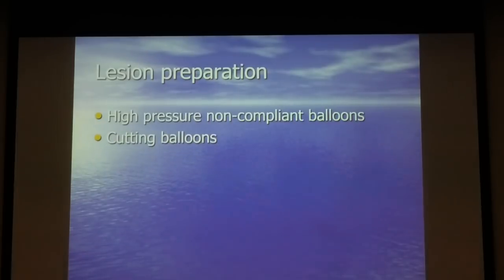And particularly in left main, you don't want to use a trial balloon and then use a different balloon. Patients can get hemodynamic compromise, hypotension, and ischemia, and if that happens, it's really a too late strategy. So use your best strategy up front. If you think that the lesion will not dilate with the semi-compliant balloon, just use the non-compliant balloon. If you think it will not really be dilatable with balloons, go to the next level of preparation.